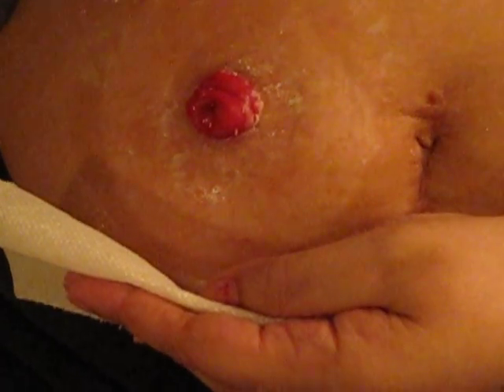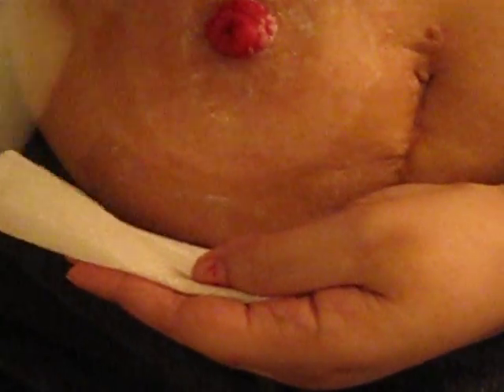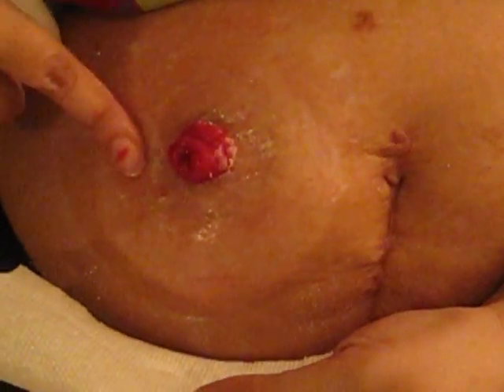What I forgot to mention — before you do that part, just make sure it's as dry as you can get. You can use your paper towels and whatever, and just fan your skin after you've wiped it off to be sure it's dry. Then apply your powders and all that. This barrier wipe stuff doesn't take long to dry — it's already ready to go. Now we cover up and get ready for the bag.